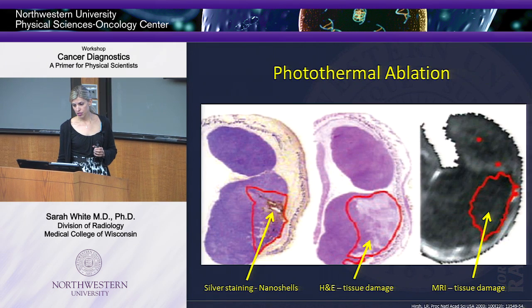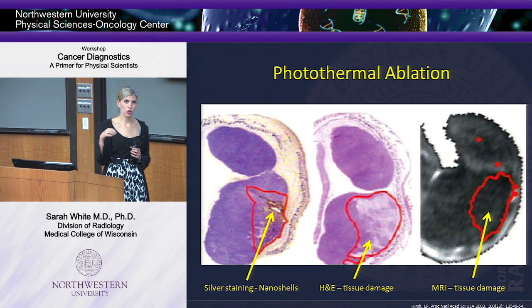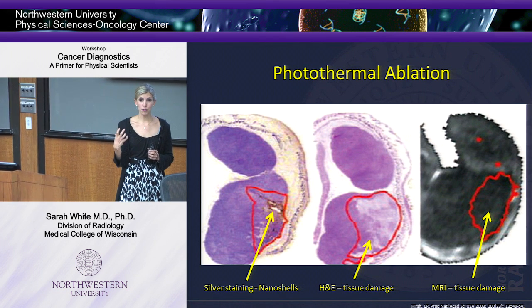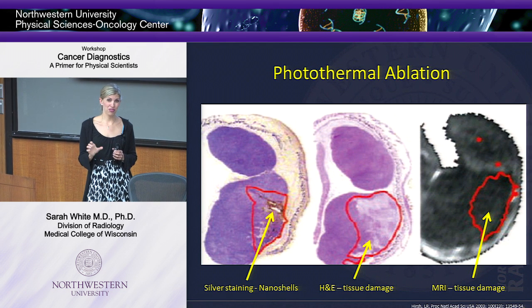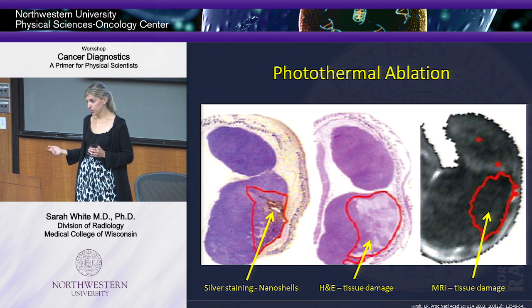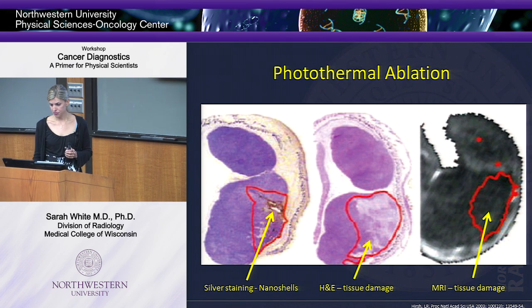And when you do this, you can do what's called photothermal ablation. So we talked about ablation before, freezing, burning. Photothermal ablation is sort of like burning, and if I inject those nanoparticles with that gold shell, it'll heat things up, and it'll actually improve my ablation zone. So right now, I'm sort of limited about 3 to 4 centimeters for a tumor. With this technology, I can infuse something either directly into the liver or into the IV systemically, and I can get a bigger ablation zone, and that's sort of just what it's showing you there.